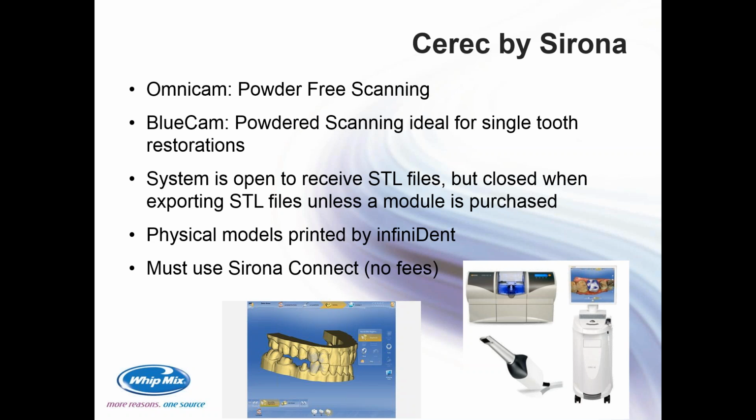So I think I know there's been a lot of talk out there as far as them opening up completely. Now, they can be opened and export an STL file, but last I heard that module is $5,000, so that would have to be on either the doctor or the lab side if they wanted to pay that $5,000 module, to be able to open the system up completely, and then at that point in time, it of course would be able to import STL files, but then export an STL file.